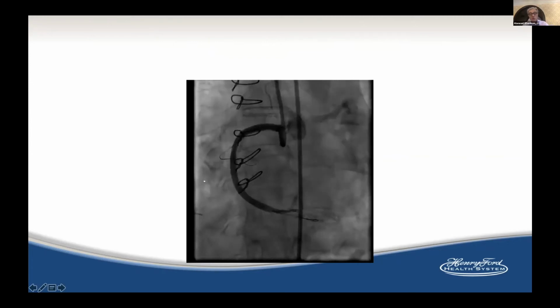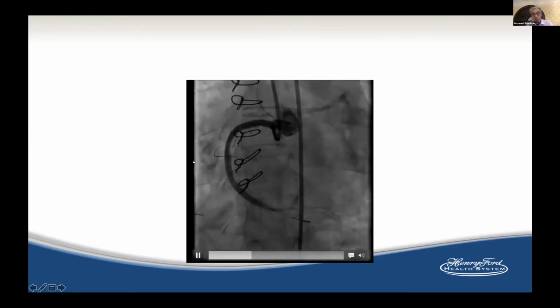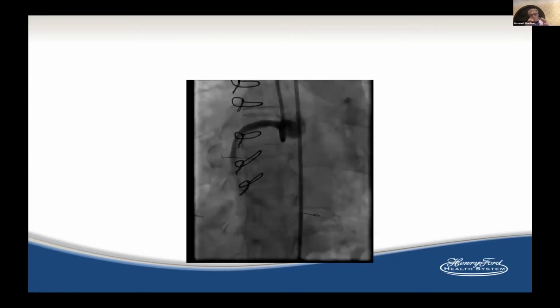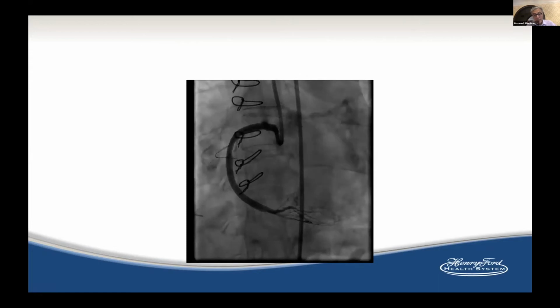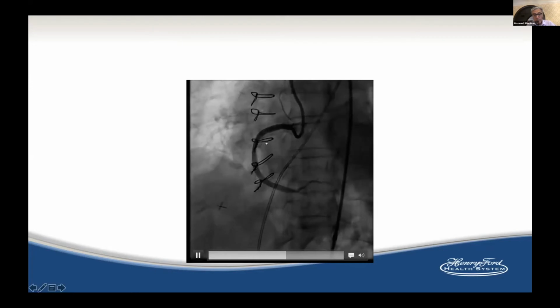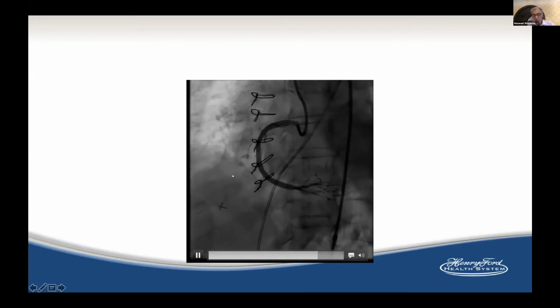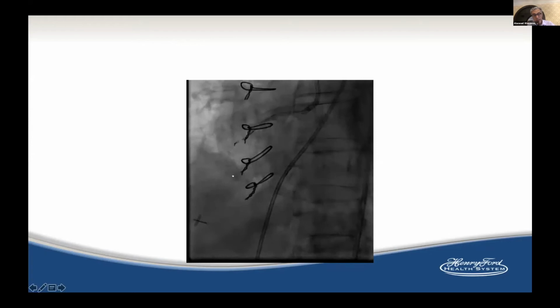This is a very dangerous situation. If you have a hematoma, the RV gets compressed. And this is post-CABG, so you can't really tap this. There is no way to tap it. It's not free flowing. It's just building up, compressing your RV. So it's very important to react immediately. And this is how we treated this. We kept the wire in there. We started with balloon tamponade for a long time. Then we looked, and there is a bleeding. So I wired it, and through a microcatheter, I delivered the coils.